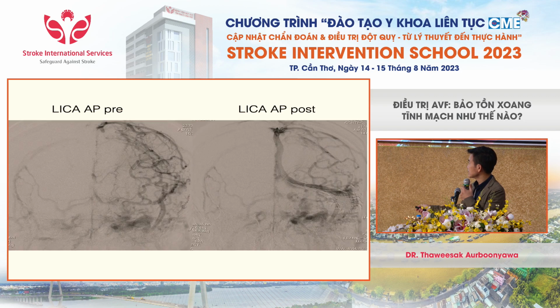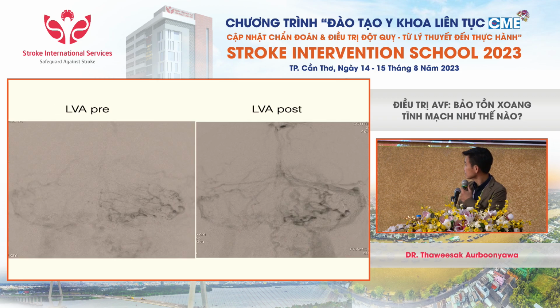Now, if you see before and after, the normal brain can drain into the superior and transverse sigmoid junction on the left side, which is the only drainage left. Before and after the operation, you're going to see left transverse and sigmoid junction preservation.